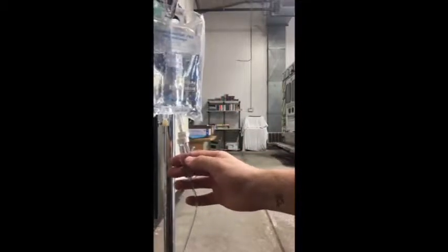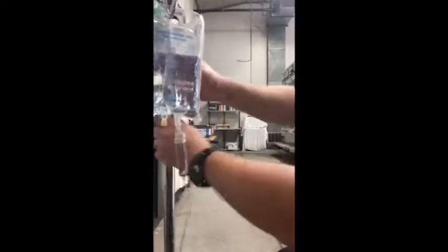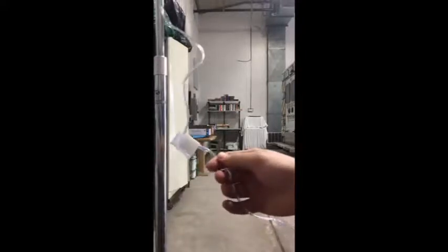And fill the drip chamber about 9/10 full, most of the way full. That way it's harder for air bubbles to get in there. If it's running really fast, you'll end up with air bubbles. So now that we have the drip chamber full, then what we can do is take our tubing, invert the drip chamber upside down, and that way then we can open up your roller, and that way it'll go at a slower rate. You can massage all the bubbles out of the bottom of it.